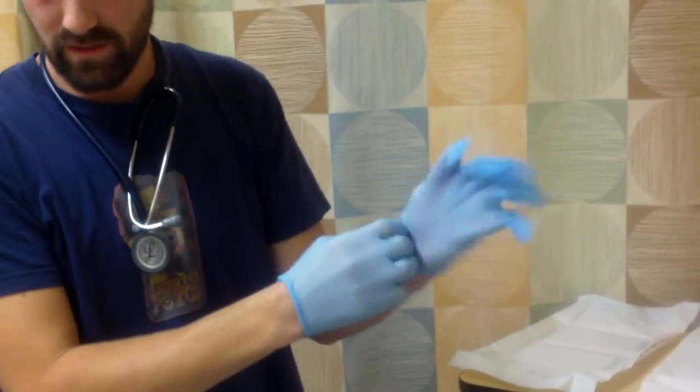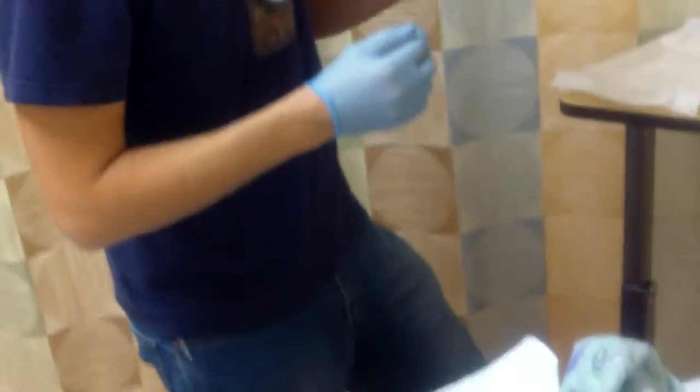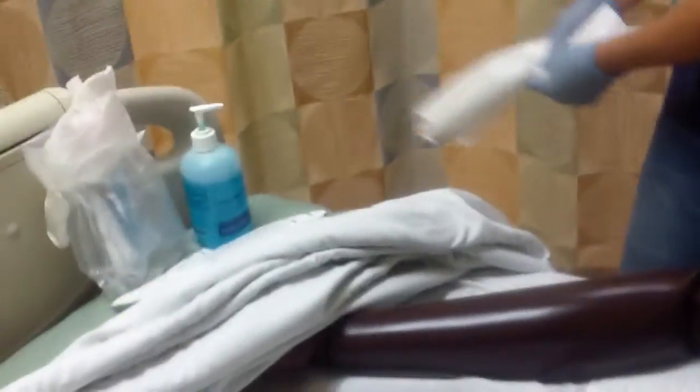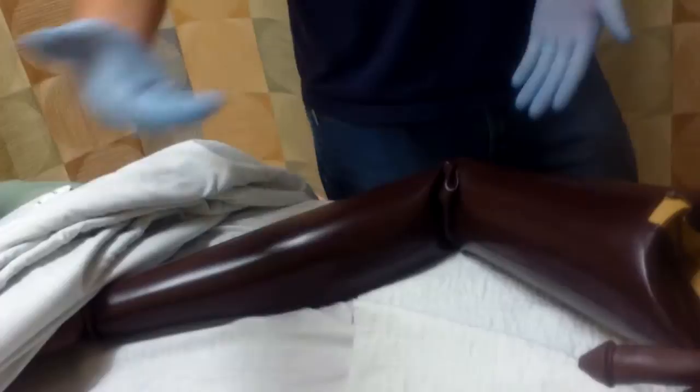So then I have a basin full of urine here. I would move my tray over here. I'd want to delicately take my urine tray and just set it over here for right now so I can clean up. I would get rid of all of this. This would just be garbage. I would just throw that right away in the trash. And then the patient can then close his legs, and I would provide for a little more privacy.